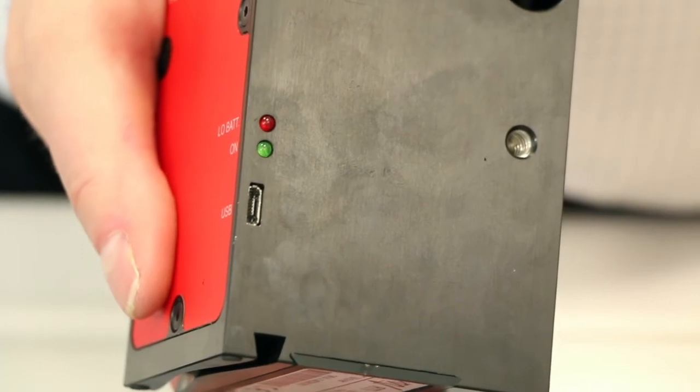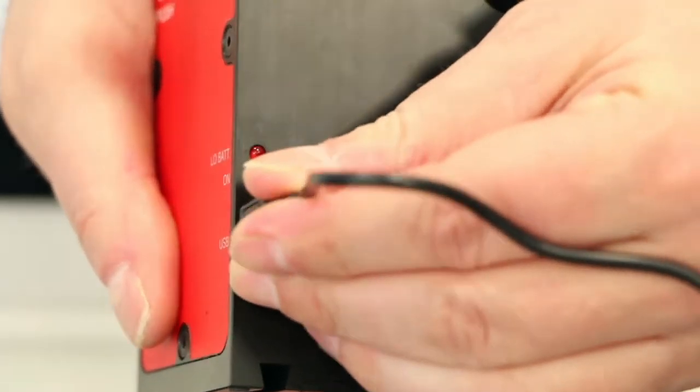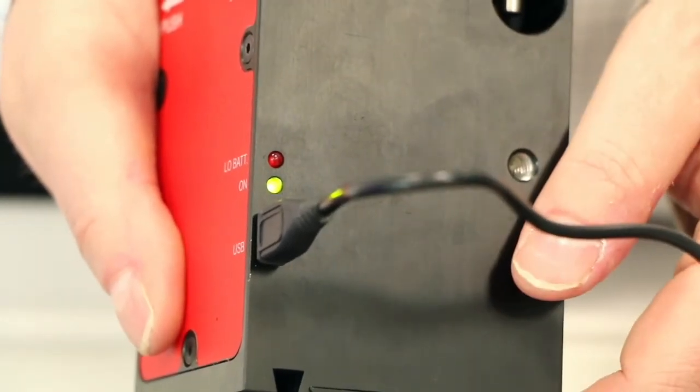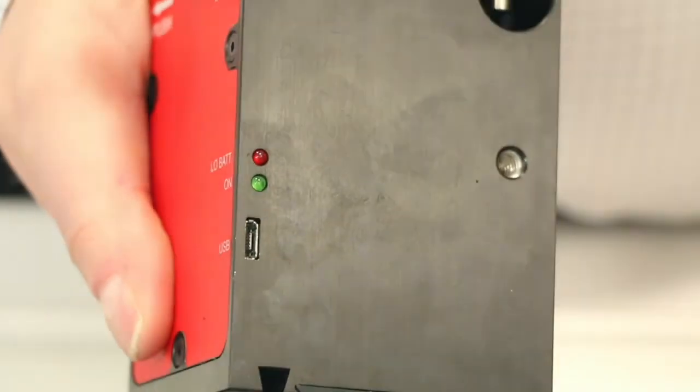Note that the mover doesn't have an on off switch. It powers on automatically when you connect it to a USB port. Therefore it is important to disconnect the mover after measurements. Otherwise the batteries in the mover will get drained.